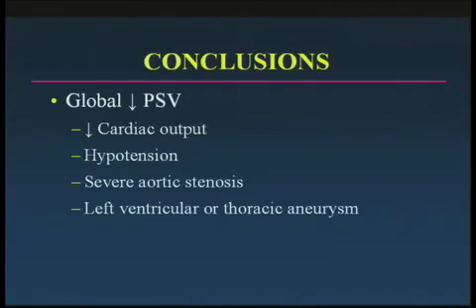All right. And if you see a global decrease in peak systolic velocity, think about things that decrease cardiac output, such as hypotension, decreased ejection fraction, severe aortic stenosis, and left ventricular or thoracic aneurysm.